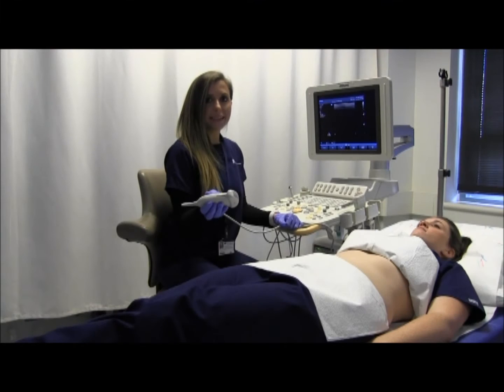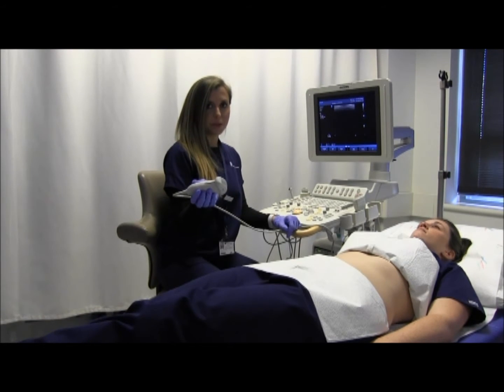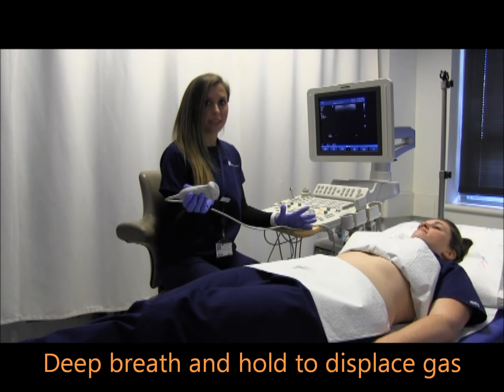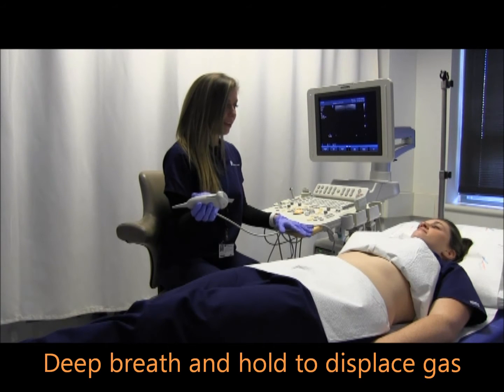Some breathing techniques that can be used to displace the gas in the abdomen include asking the patient to take a deep breath and hold it. Can you take a deep breath and hold it?